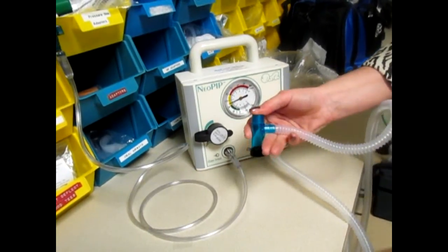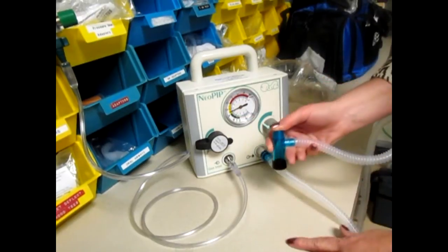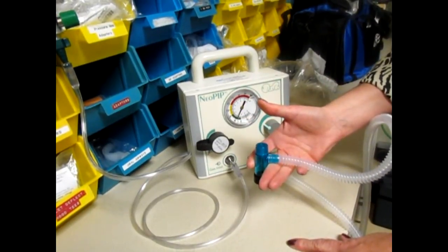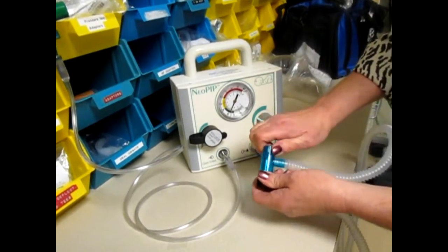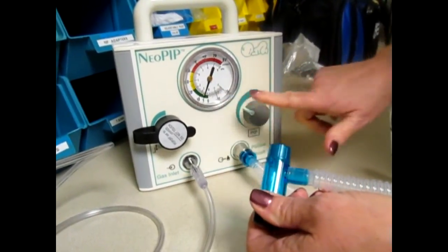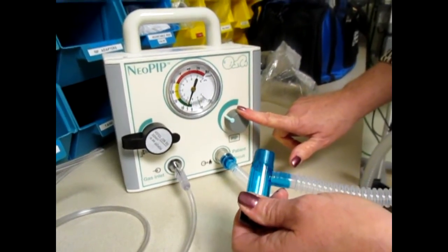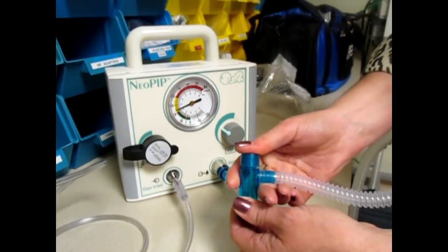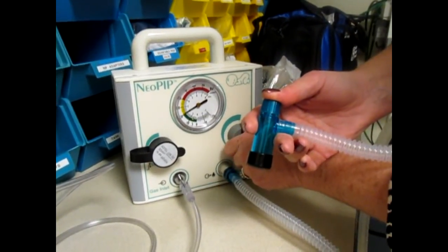Any time they have their thumb occluding this, it's giving an inhaled breath, inspiratory pressure of what you have set on the manometer. Every time they let go, they're exhaling for the patient and they're exhaling down to the PEEP that's set. So again, as I turn this, I can manipulate my PIP. This knob manipulates the PIP. Do you understand the 20 over 5? 20 over 5, and it looks like I need to come down a little bit on that with that leak.